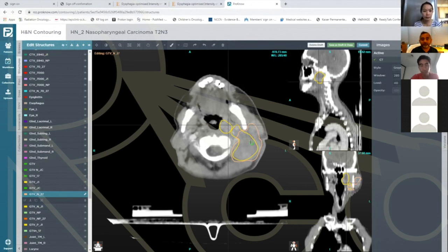As I mentioned, half my nasopharynx cases are actually when they recur, because we don't see very many nasopharynx cancers here. When they come back from other places, I usually see 1 or 2 cases a year where the patients have failed in the parotid gland. What I find is that the prior planners and the treating physicians have been super diligent about sparing the ipsilateral parotid gland.